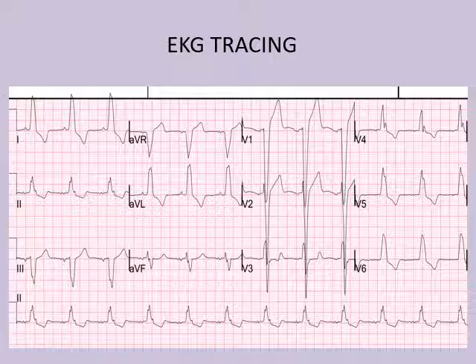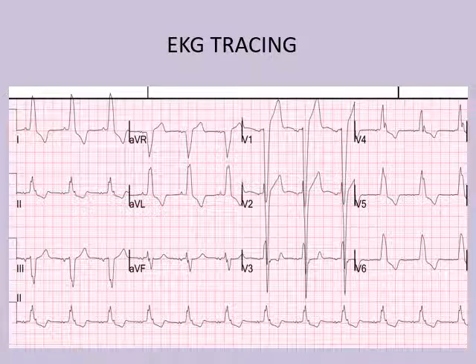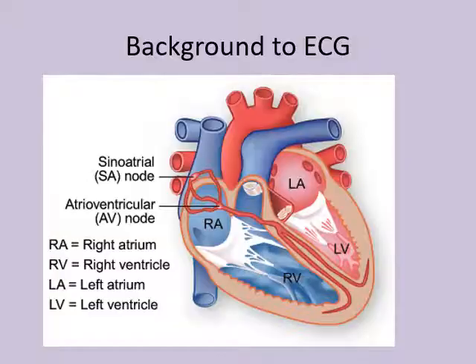That's what I'm saying: a cardiologist can look at this and say, oh, look at that, that's not quite right. He has heart damage down here in this part of the heart because this direction isn't quite correct, or the tracing isn't high enough, whatever it is. They're pretty incredible. So this is what a 12-lead tracing ends up looking like when it comes out of the machine. And don't worry, I'll never give you anything this complicated because there's no way I could even read these. All right, so here's the background again, just a little reminder.